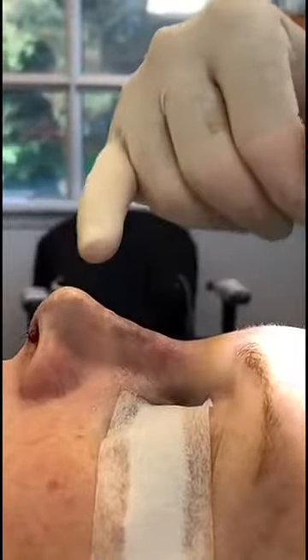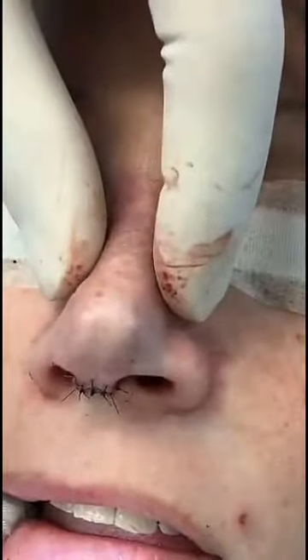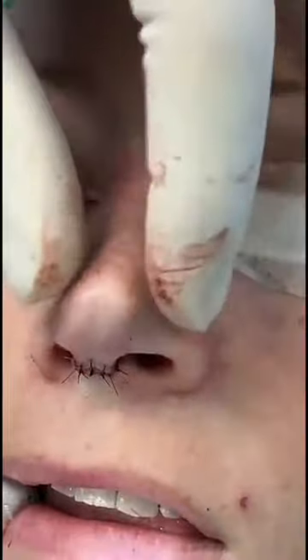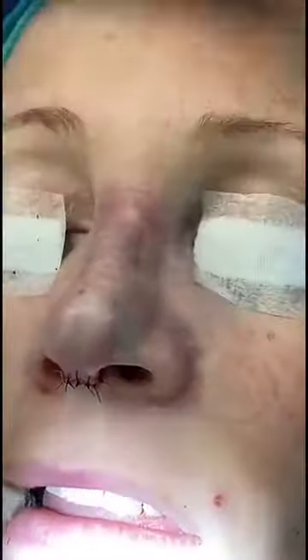So we've sutured it up. You can see that the bridge has a nice slope into the tip, which is projected above the bridge. If you turn to the front, this part of her nose is much straighter than it was before. The tip is defined, and while it may not be perfectly straight, she's going to have a great improvement.